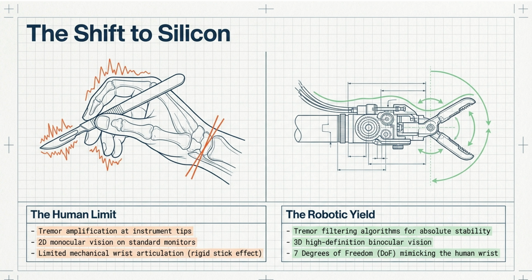Okay, we're going to continue on with robotic surgery. Just a little bit of information here for you for robotics. This is becoming more and more prevalent.